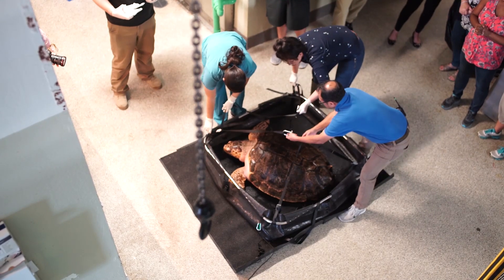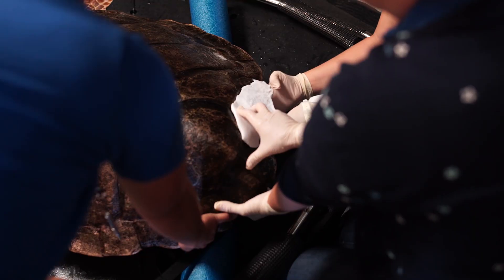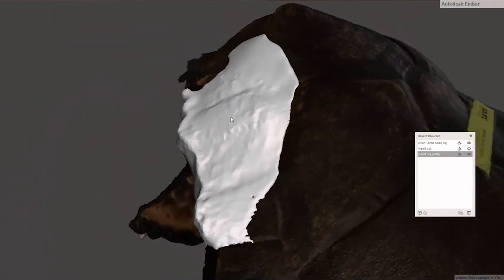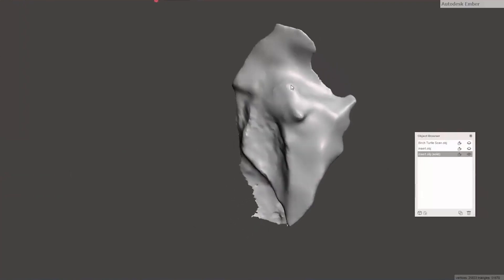The gap, along with an abnormal curve in her spine and paralysis of her back flippers, is likely due to trauma experienced in the wild before she was rescued. The Digital Media Lab at UC San Diego's Geisel Library was recruited to help design and print a brace to fit in the gap.